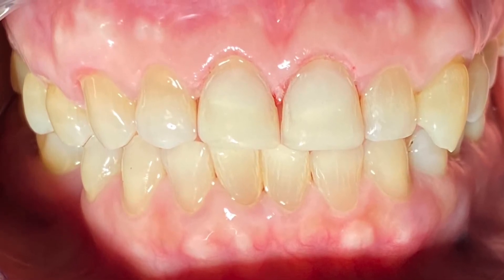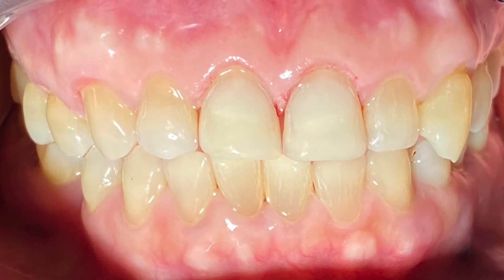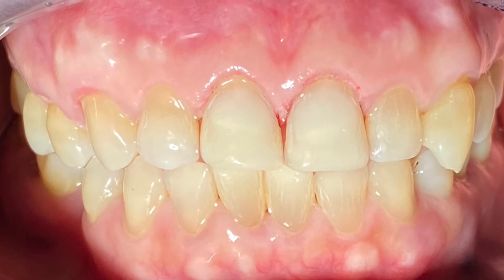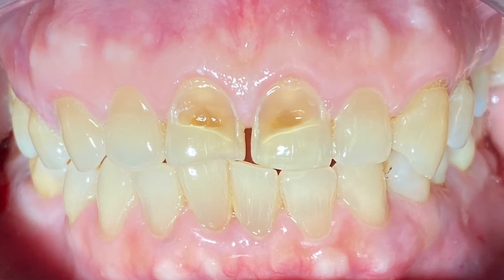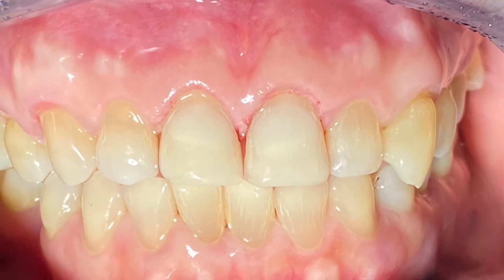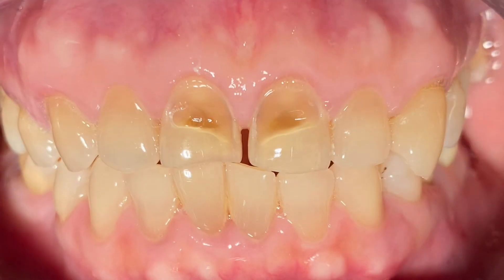So what we had to do was lower the lower teeth down and then restore the original shape and contour of teeth eight and nine. Now she has a regular bite — we adjusted the bite to make sure the lower teeth are no longer hitting the incisal edges.